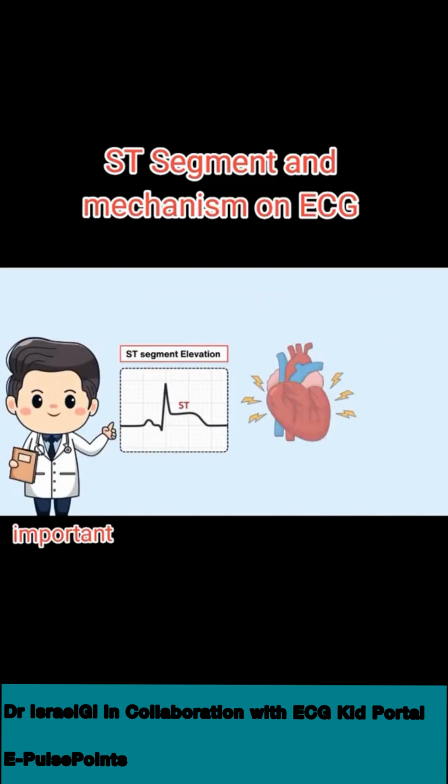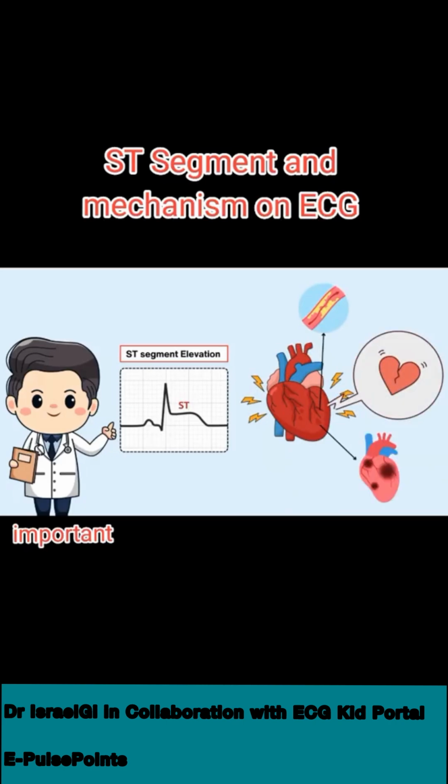ST segment elevation isn't just a random occurrence. It's a reflection of the heart's distress. It's a sign that somewhere in the cardiac landscape, there's a blockage, a lack of oxygen, and damaged heart muscle. Understanding this can be crucial for timely intervention and potentially saving lives.